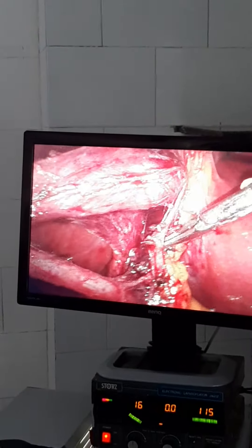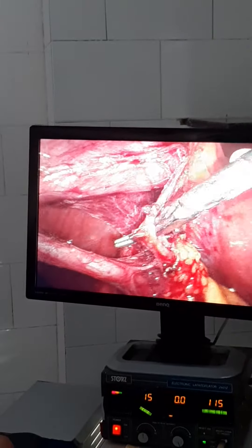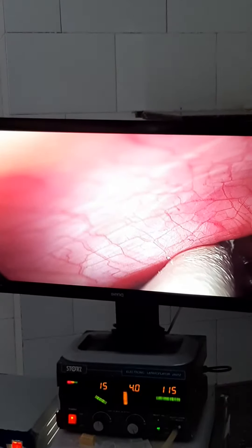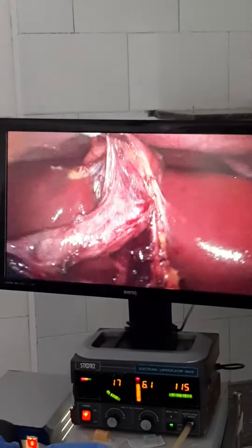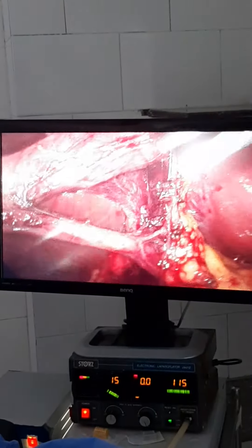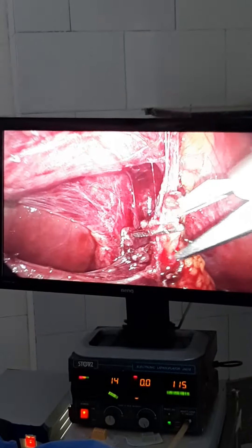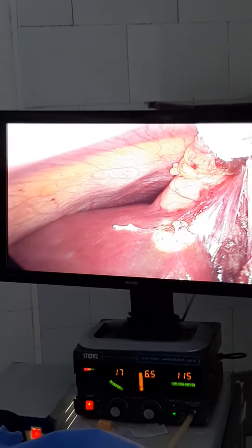Here we can see the cystic artery has been dissected well, and we will clip it now. This is the cystic artery and this is the cystic duct. We will clip the cystic artery first. We have to clip the cystic artery now — clip on the cystic artery, another one, another one.